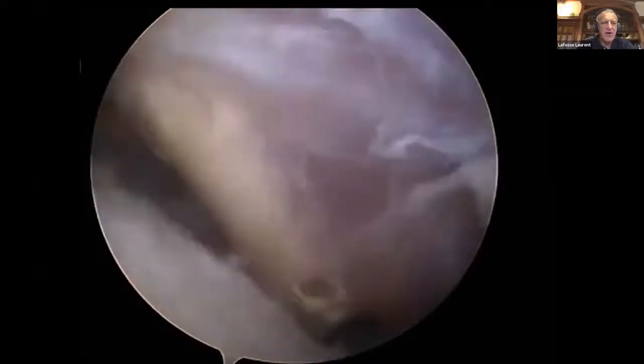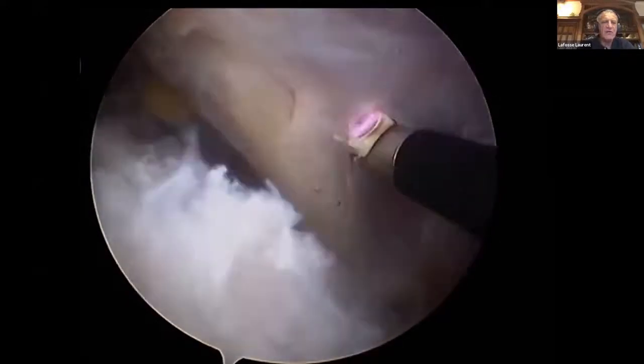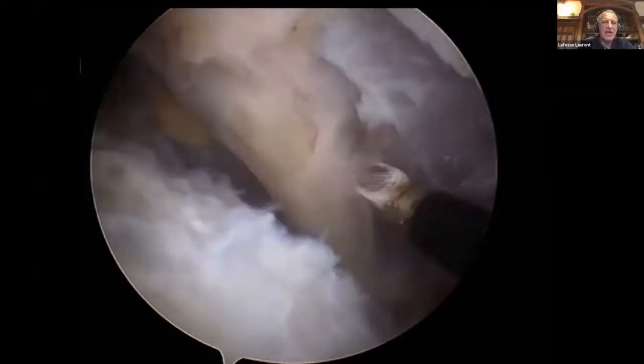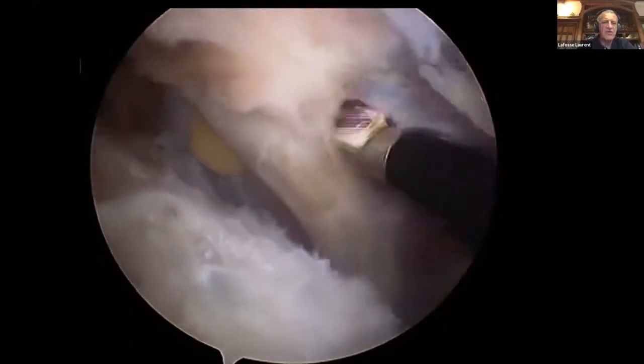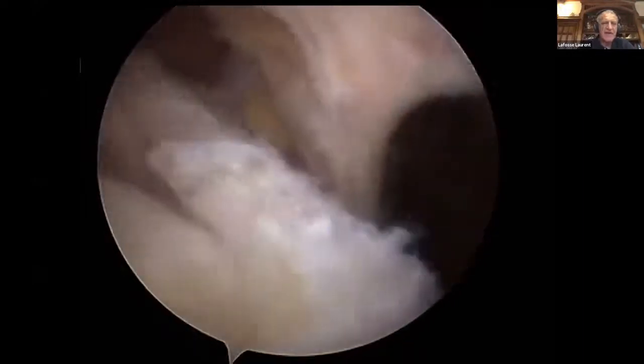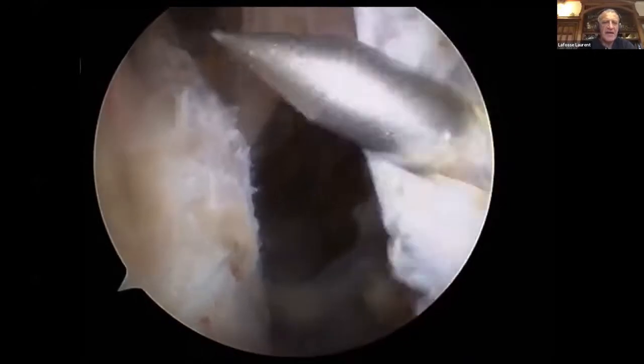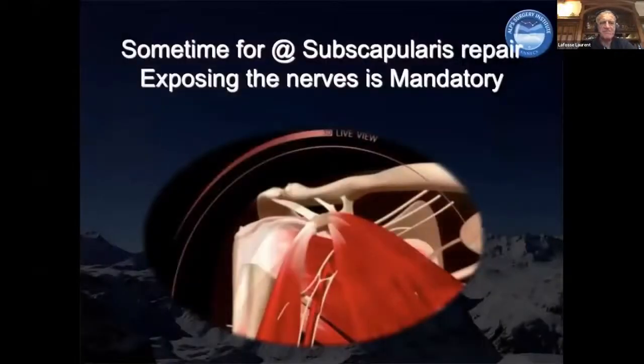The subcoracoid space is here, limited by the tendon, and you can even go outside the subcoracoid space, open the fascia to go to the subpectoralis space. Here you open and make a communication between every space. Here you can enter and try to repair and insert your anchors.